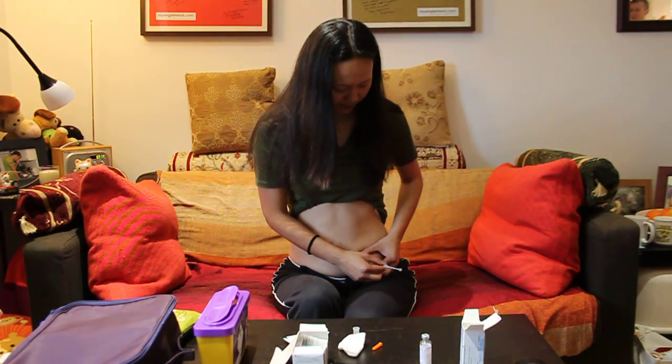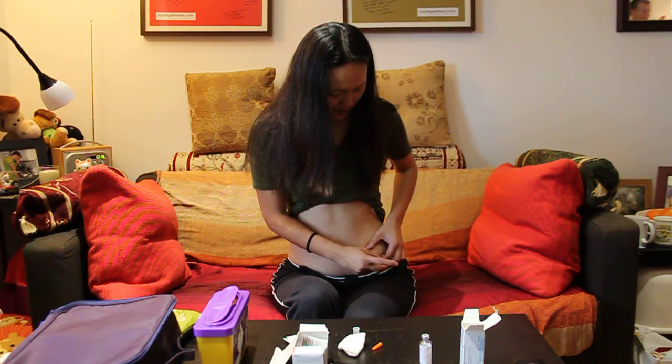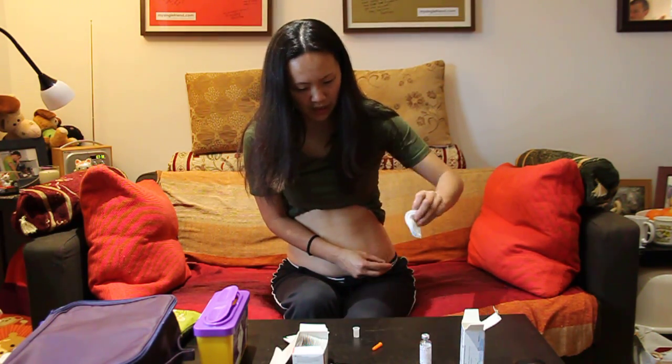And there you go — I'm in. I'm letting go of the mound now. When you're ready, just start injecting with the plunger slowly. Sometimes you can start to feel a little bit of a niggle — if you want, just take a pause, and then when you're ready, start injecting again. It's just the pain of the fluid going into your layer; sometimes it's a bit painful. I'm down to 20, now down to 10 units, and down to zero. I'm going to count one, two, three, four, five, getting my cotton pad at the ready.